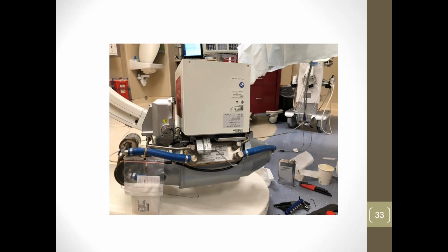So here's an X-ray tube. This would be your medium size tube that you would use on like a 30 centimeter detector. Here's the actual tube itself. You've got your cooling lines and your oil lines to help keep the tube cool during the exposures. This big clunky box up here is your collimator. And then this guy over here, at least with GE, everyone has their own way of making pulsed fluoro.